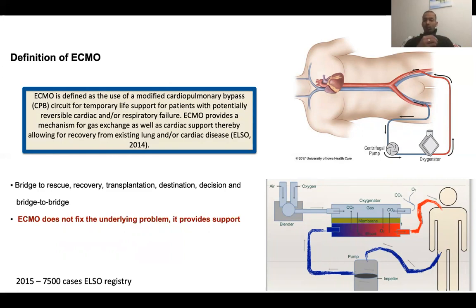So the ultimate goal is it can be used as a bridge to rescue, say sometimes used during CPR. We call it eCPR, or a bridge to recovery, hoping that the lungs will indeed heal or the heart failure will indeed get better after fixing coronary arteries, for example.